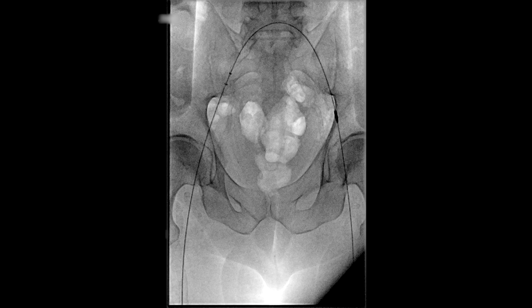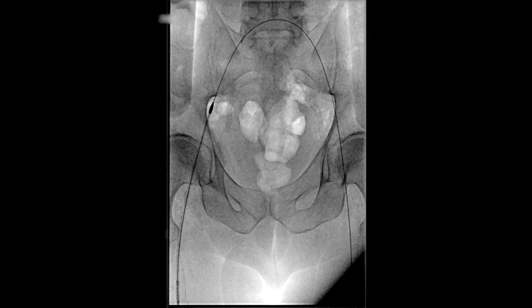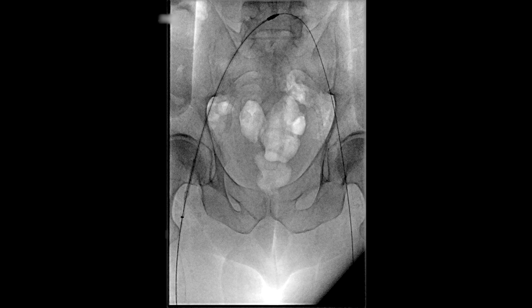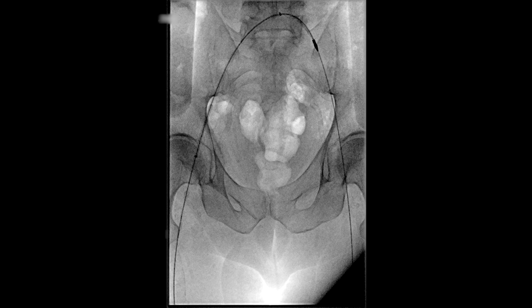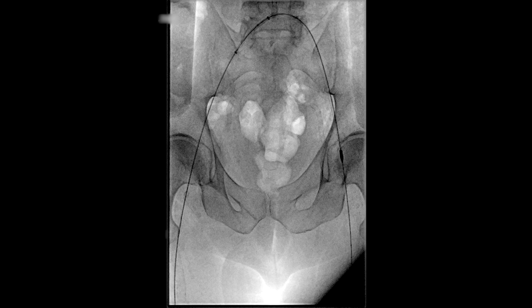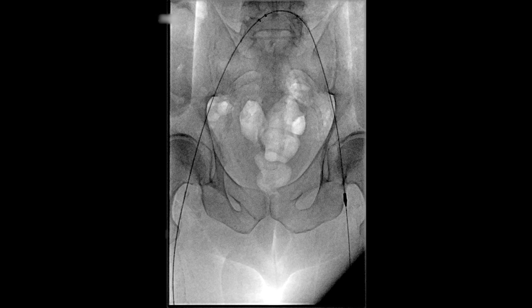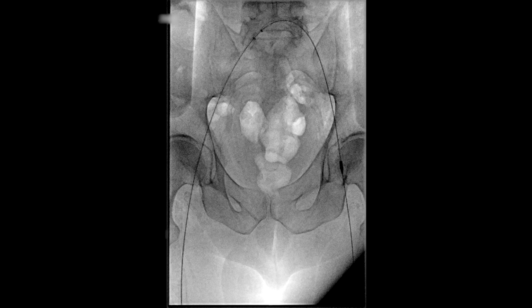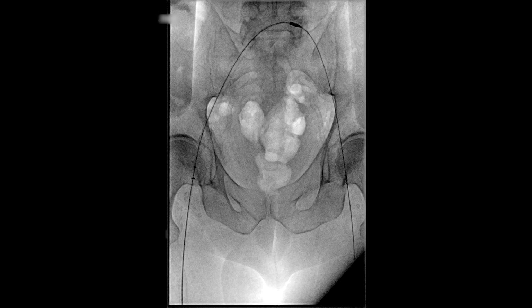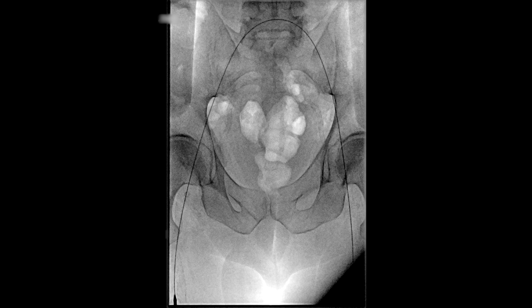Once again here, you can see the clot retriever being retracted in a slightly different orientation to facilitate removal, and then its replacement back into the patient's iliac veins in order to allow for another pass. This was repeated a total of 5 times, and we took care to not drag the clot retriever over the confluence directly, allowing it to move across the confluence without any tension so as to not have it get caught.